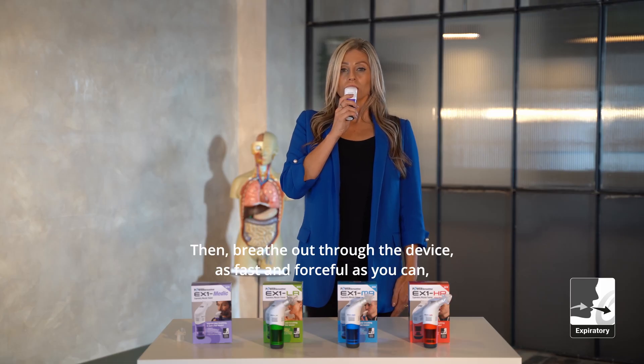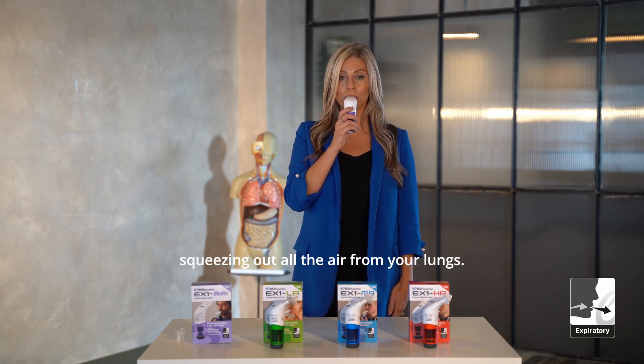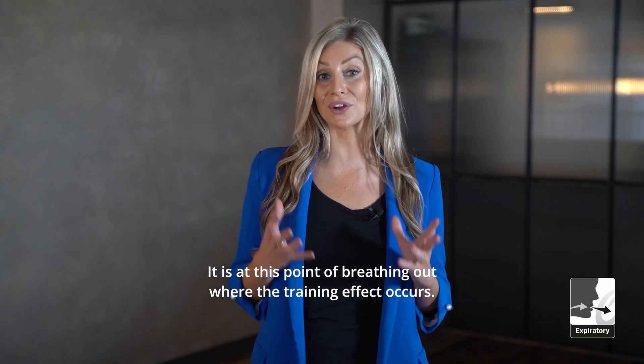Then breathe out through the device as fast and forceful as you can, squeezing out all the air from your lungs. It is at this point of breathing out where the training effect occurs.